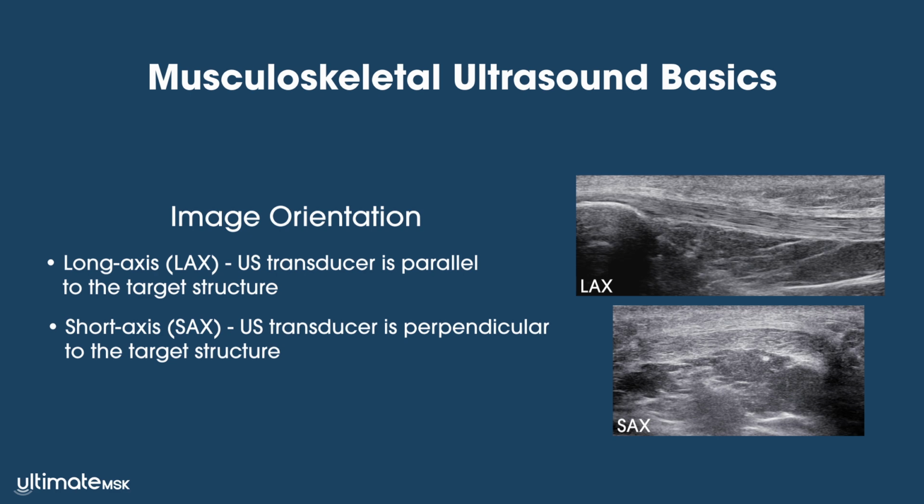One important advantage of ultrasound is the ability to dynamically adjust the transducer to optimize the long axis or short axis imaging for a specific target structure, even as its orientation changes along its course. For example, this flexibility is particularly beneficial when imaging ankle tendons, which change anatomic planes as they traverse from the lower leg, around the ankle, and into the foot region.